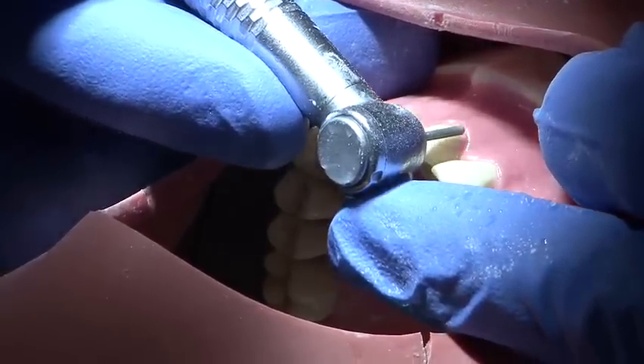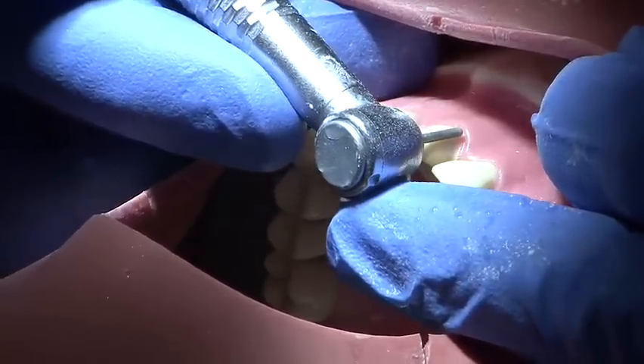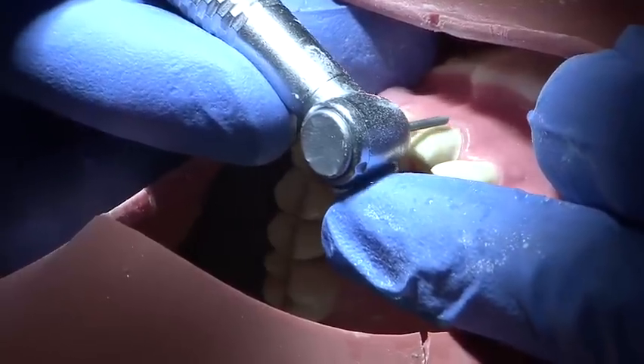The gingival margin should be followed to ensure evenness of preparation, and it is essential to use the putty matrix to ensure that reduction is even throughout the preparation.